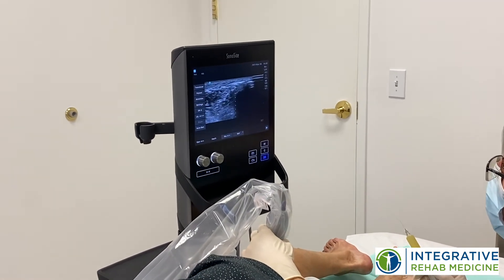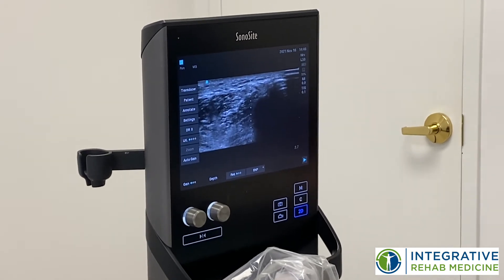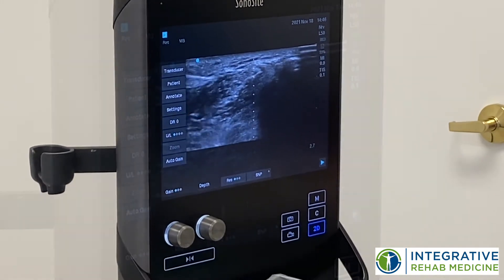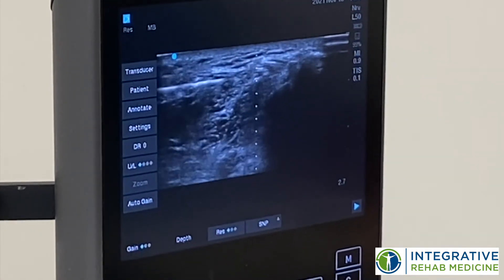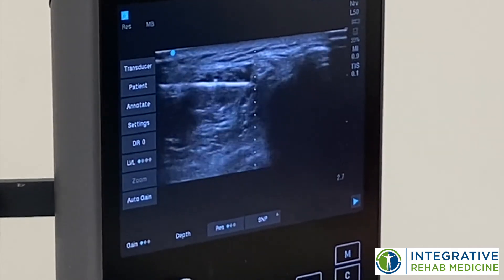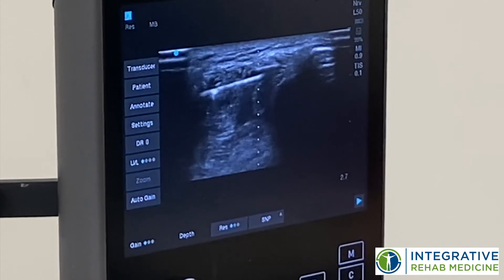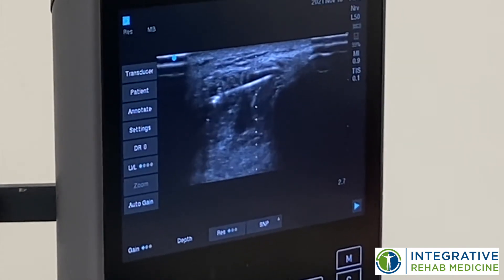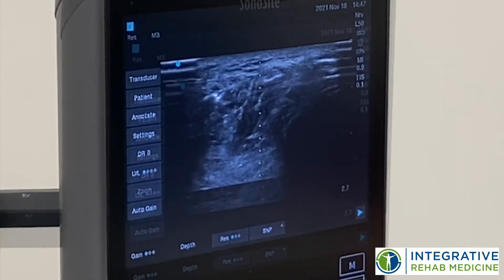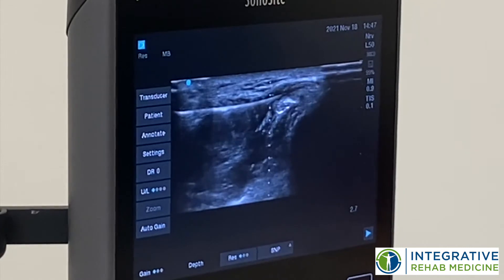So here we are, we're going to treat the fibular nerve. That's the nerve that gives us sensation of the top of the foot, but also gives us the motion that allows us to lift the foot when we're walking. And inject right around it. Here it is just underneath the nerve. I'm going to come above it, separating tissue away from the nerve.